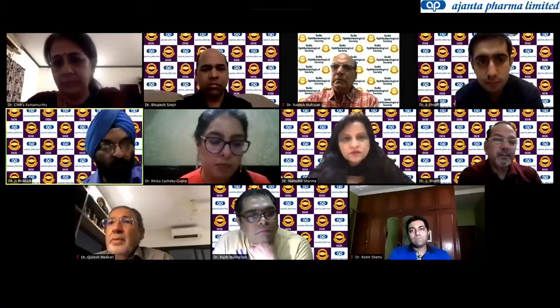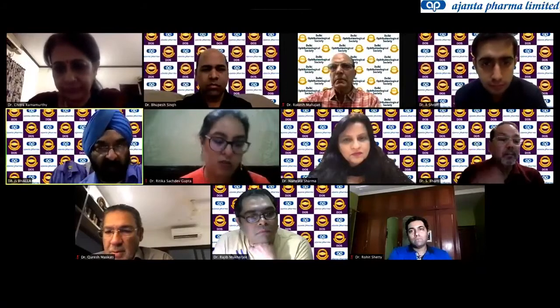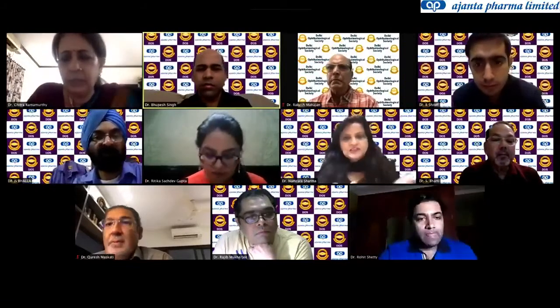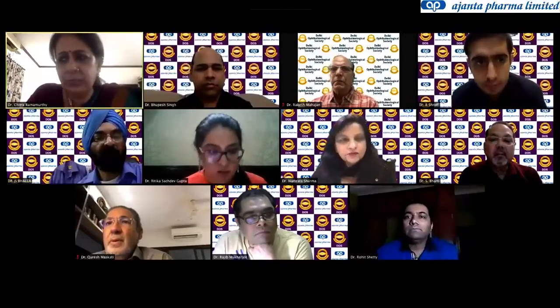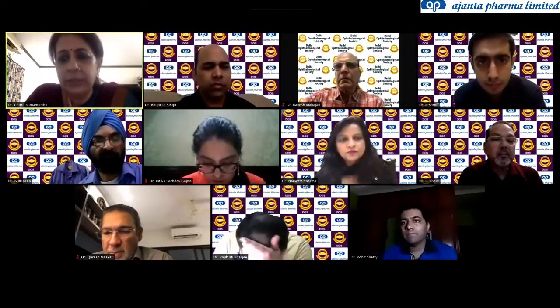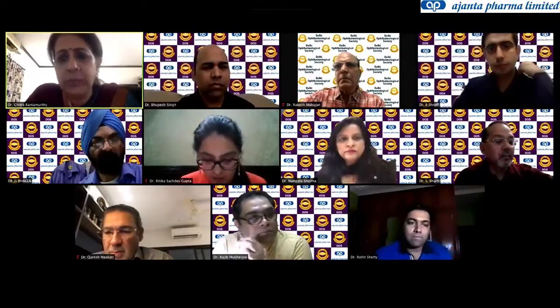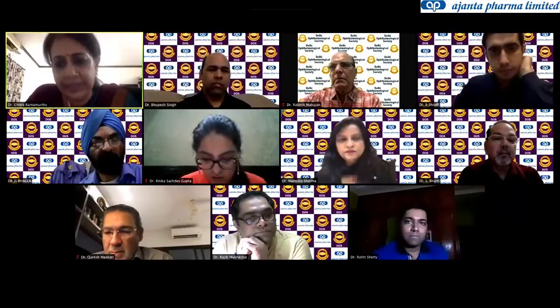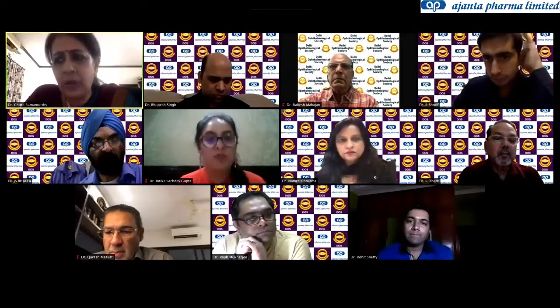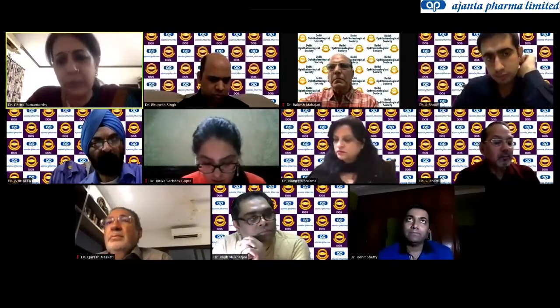What is the role of Corvis in diagnosing keratoconus or forme fruste keratoconus? Maybe Rohit sir can answer. Corvis is definitely one more indicator to understand biomechanics a little better, but it doesn't mean that if the TBI is in the red, I would believe the cornea is truly ectatic. It has to be a combination of factors. So whether it's Corvis or the Ocular Response Analyzer, these are all very much the tip of the iceberg as far as measuring biomechanics.